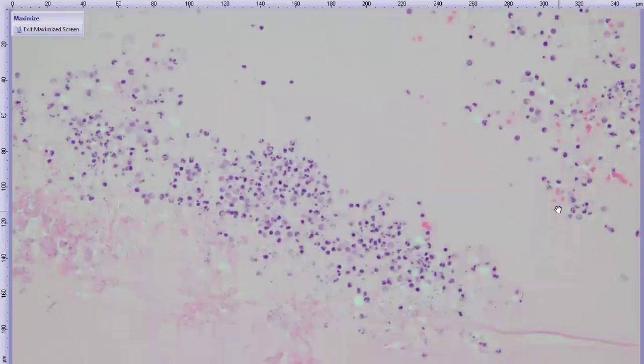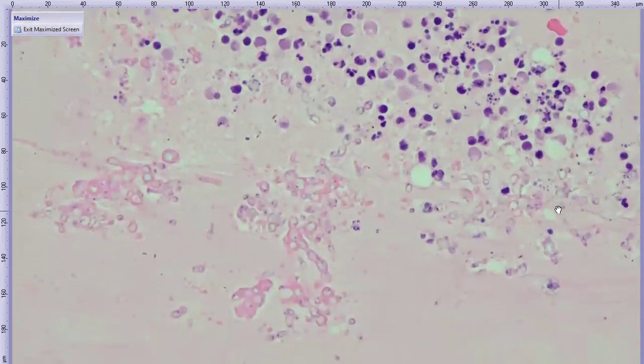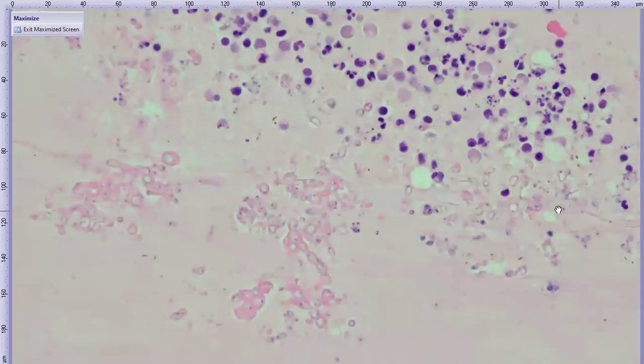So the purple is still the inflammatory cells, but as we get closer to this area here, there's this weird pinkish stuff. Looking even closer, it turns out the reason why it looks kind of funny there is because we have all sorts of microorganisms here. Ooh. Look at these. Oh, thank you, Gillian. So we have over here our inflammatory cells. So these actually are cells belonging to the patient. So neutrophils and probably some macrophages. And then these are infectious microorganisms.